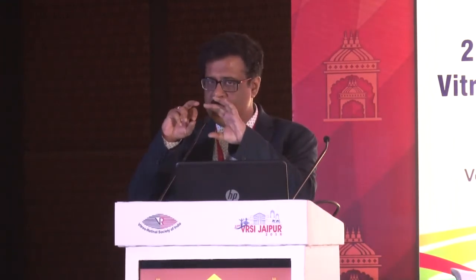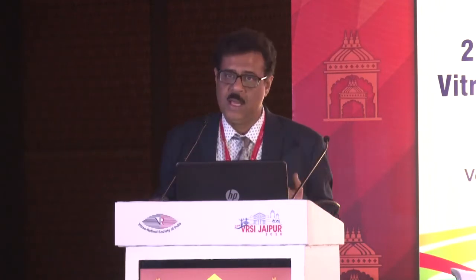Yes, I have a small idea regarding the glass foreign body, what you can modify. You have 4 paws, and you can put some kind of rubber-like material here so that when it grabs any object, even if it is slippery, it will hold. If the tips of the paws are metal and glass is absolutely smooth, it will create very little frictional force to hold the foreign body. If it is a soft tip, like rubber-like material on your paw, and you hold the glass foreign body with that forceps, that will create quite a big amount of frictional force. So that's an excellent idea, but yes.